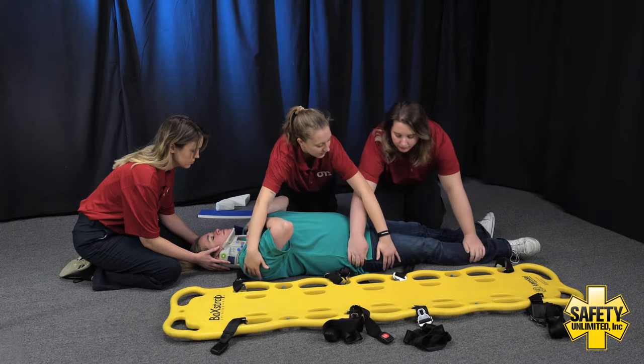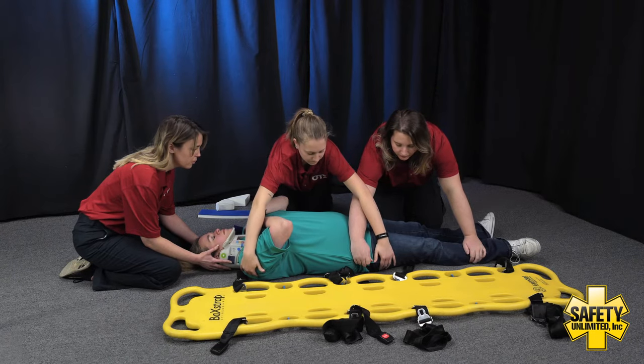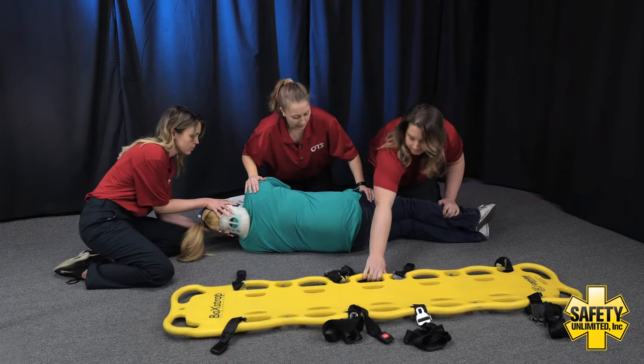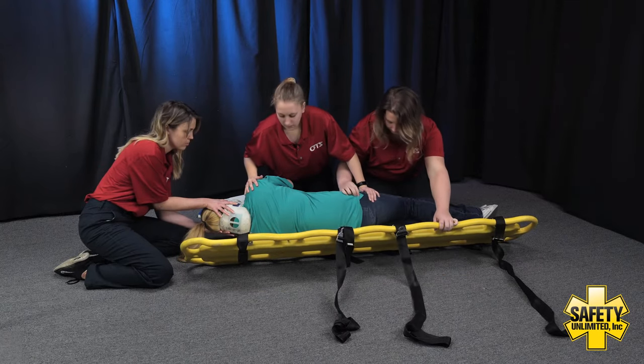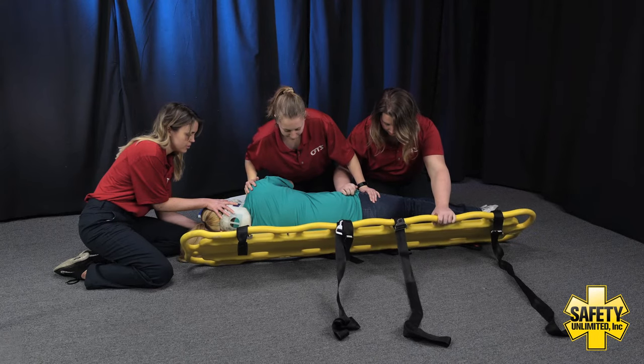EMT assistant will go above mine and on the lower extremities. On the head's count, whenever you're ready, we're going to log roll. On three — one, two, three. Now I'm going to have my EMT assistant bring in the backboard, getting it nice and close, held at a 45 degree angle. Now that we are ready on the head's count, we're going to roll back onto the board. On three — one, two, three.